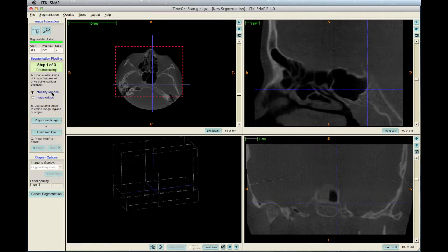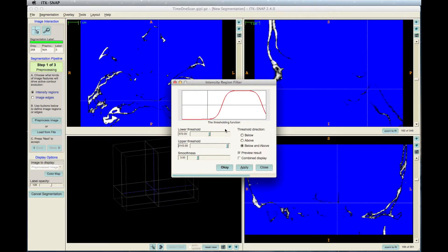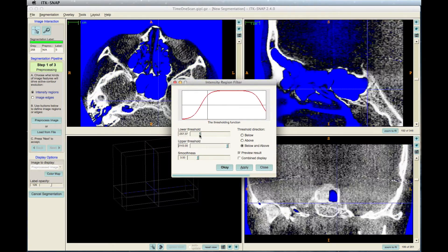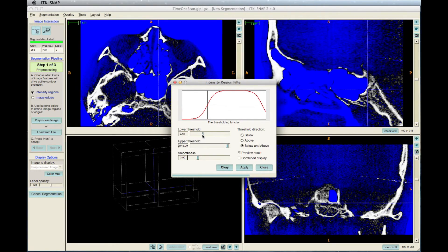The next step is to choose either intensity regions to start the segmentation from zero, or image edges to make retouches when the segmentation is already done. Click Pre-process Image, then in the window that pops up, adjust the lower and upper threshold, and then the smoothness, to make the bone visibly white.